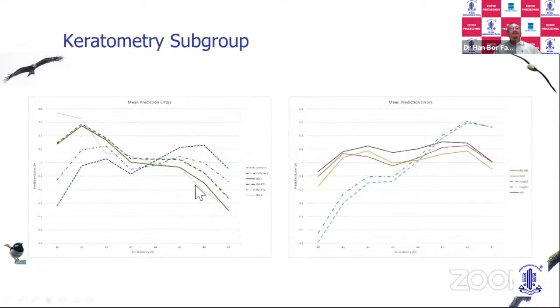What about K? This is based on keratometry, the traditional formula. You can see it's again SRK/T and Haigis as well. Haigis is here. They're sensitive to K. That means their predictability varies with K. Hoffer Q and Holladay are less sensitive to K. And again, the newer formulae, like Barrett, EVO, and RBF, are kind of neutral to K.